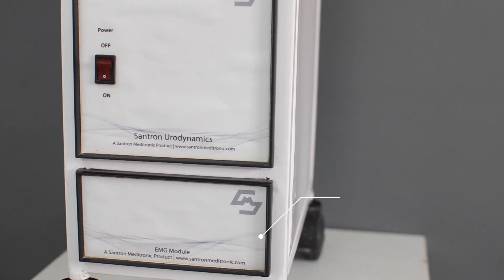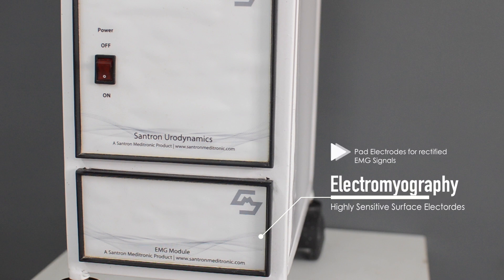The electromyography unit offers electrical isolation from the machine supply and the patient for rectified EMG signals.